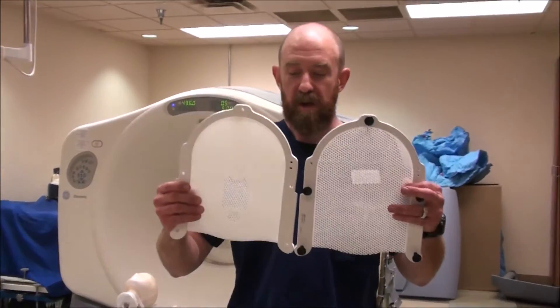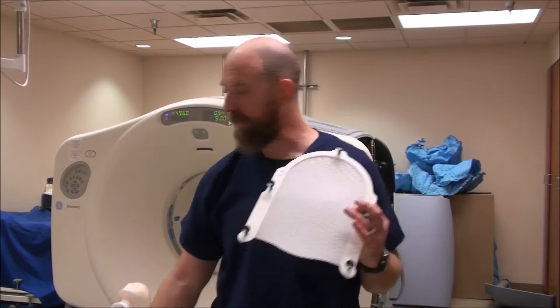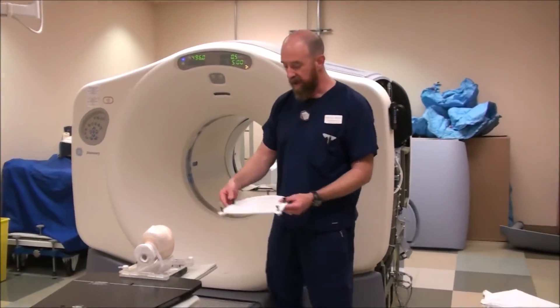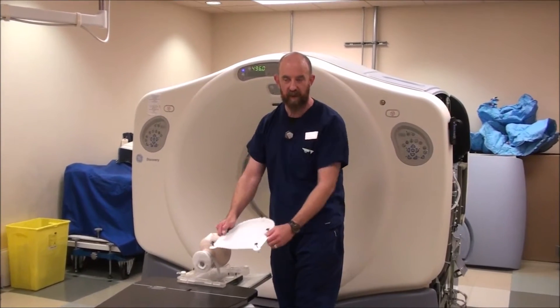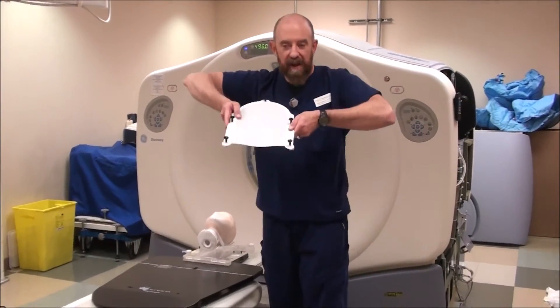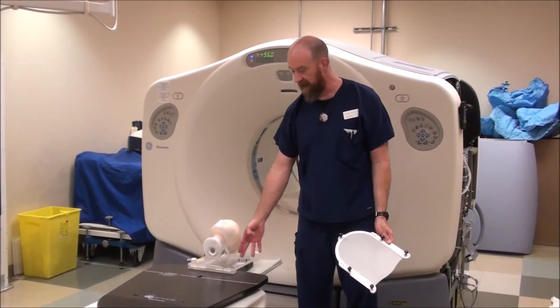But you're still going to be shooting for the same place — the chin needs to be right about here. You don't want the mask itself hanging all the way down on the neck, pressing into the thyroid because that's uncomfortable. You don't have to make trims on the mask just to make it so the person can swallow or be comfortable enough to tolerate the treatment. So you aim thusly — you kind of hold it at an angle, touch the chin, and go down kind of in an S shape. What that does is it drapes it across the chin, gets it on their forehead, and then pushes it down so that you make contact with the head frame.